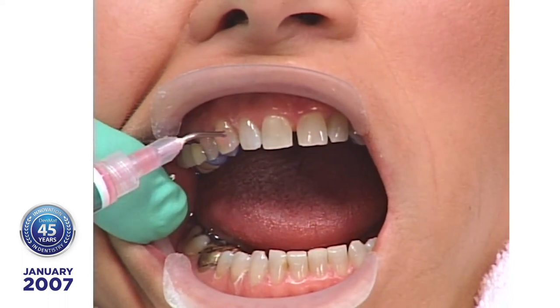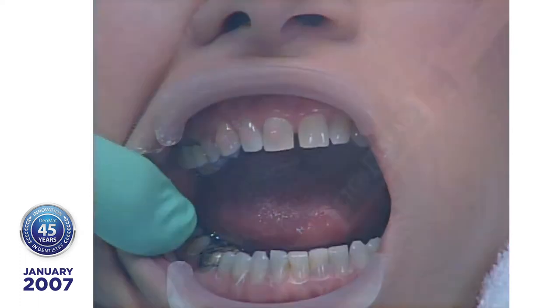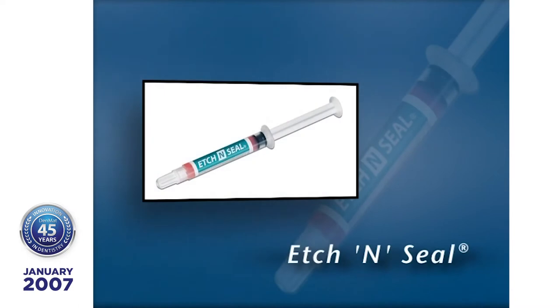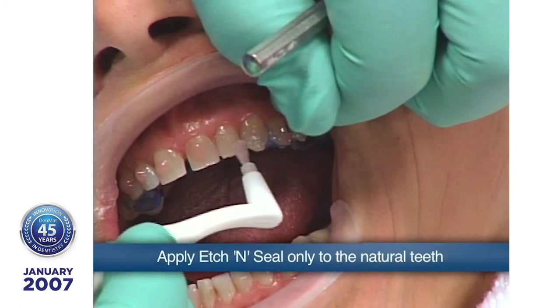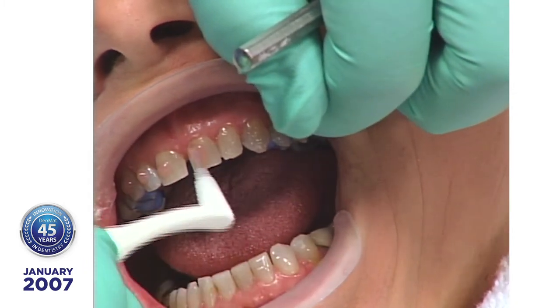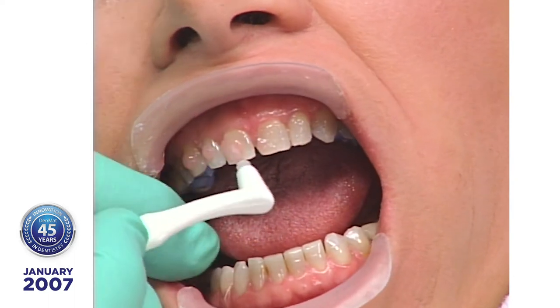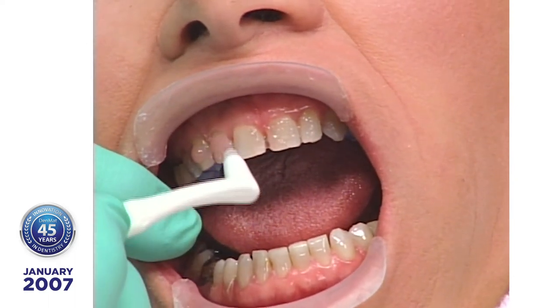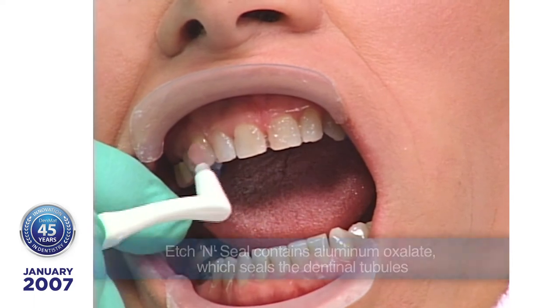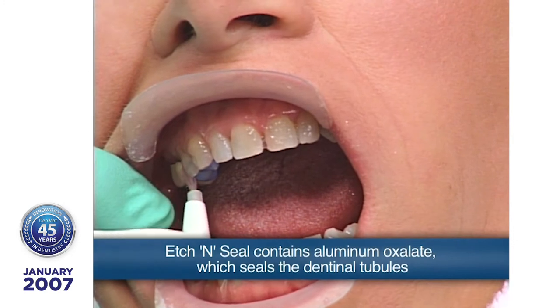Now I'm using Etch and Seal, which is a medium viscosity. It also contains aluminum oxalate — you just push it around and it stays where you place it. If you were using this in regular operative procedures and had exposed dentin, then the aluminum oxalate would seal the dentinal tubules.